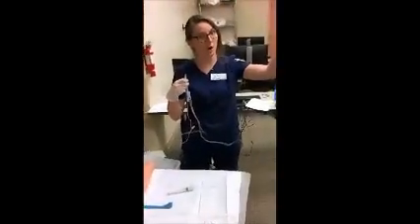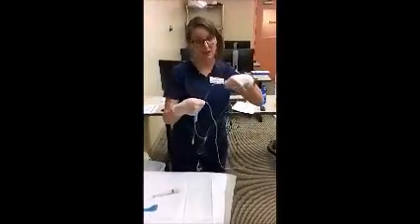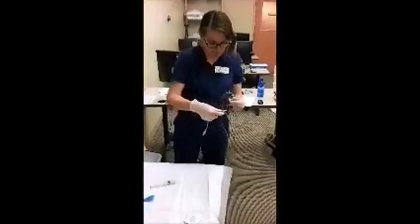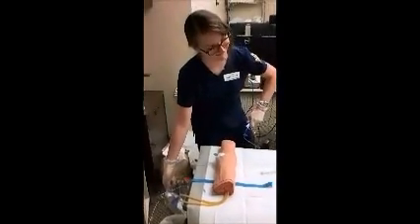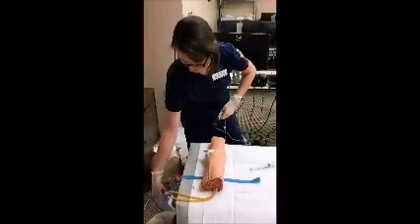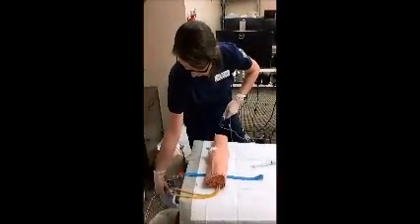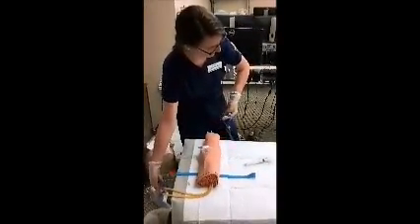So we've already verified this with the MAR when we walked in the room. We verified that our infusion was for this patient and it was the correct dosage. I'm seeing some air again in the lines, and so I would just flush the line again, because it doesn't hurt. There it goes. There we go. Got a couple big bubbles I wanted to get out of there.